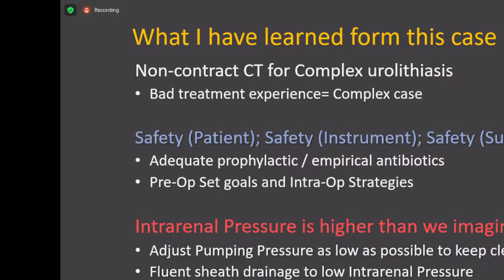First, for patient safety, you need adequate prophylactic or empirical antibiotics, and you need to keep your instruments safe. So for some complicated cases, we always use a single-use flexible scope, and you need to choose the surgical technique you are familiar with. I think it's good for surgeons, and we need to set the pre-op goal and the intraoperative strategy.